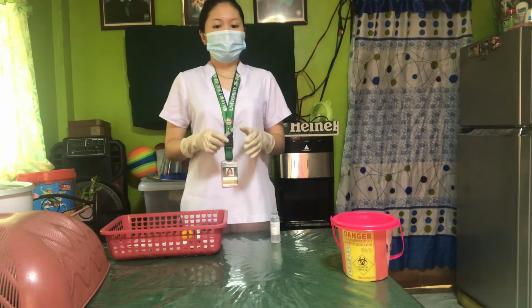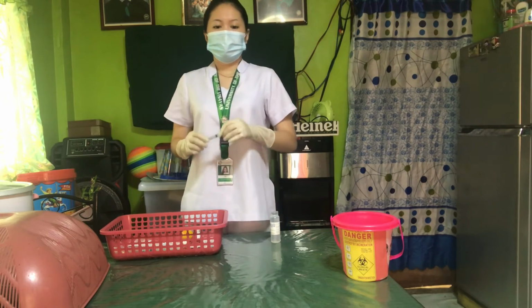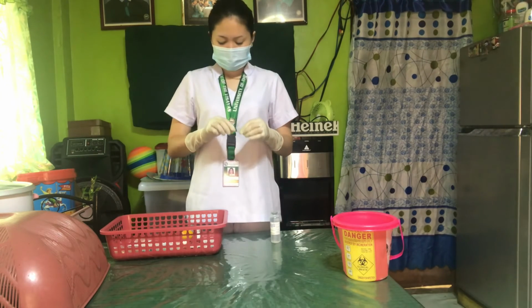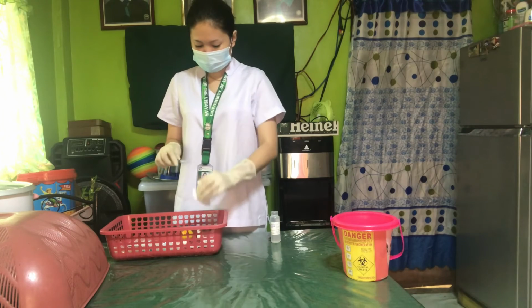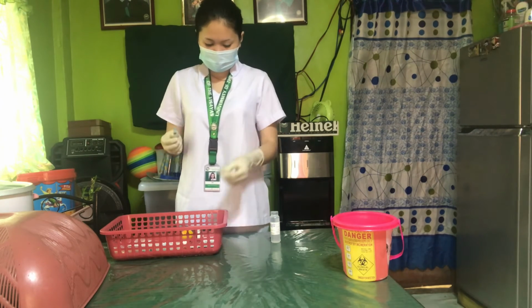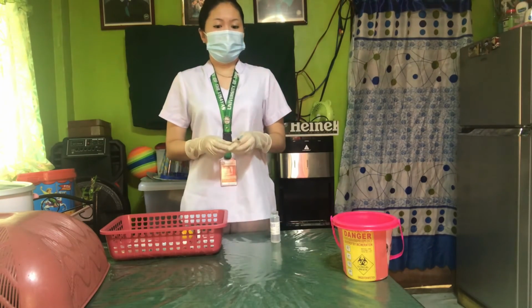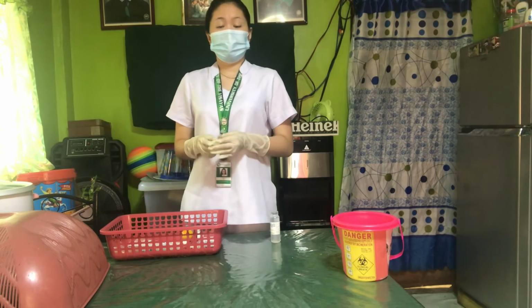If not enough air is injected, the negative pressure makes it difficult to withdraw the medication. So assuming that my doctor ordered 1 ml of medication, I will draw also 1 ml of air.